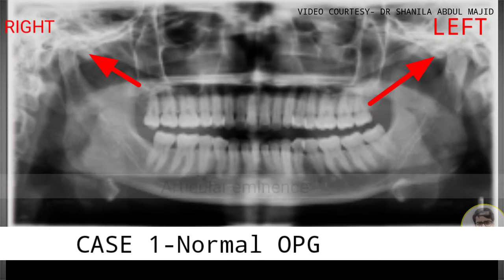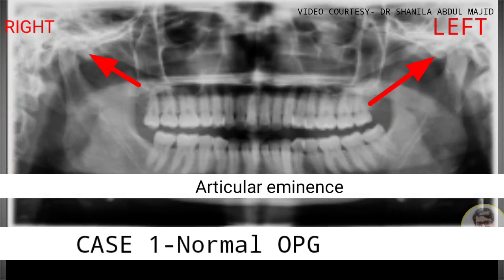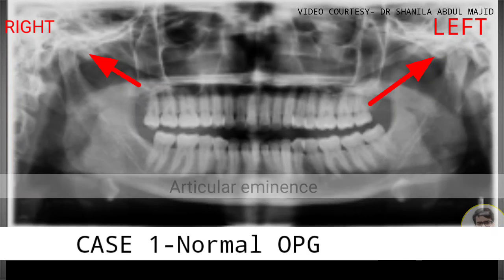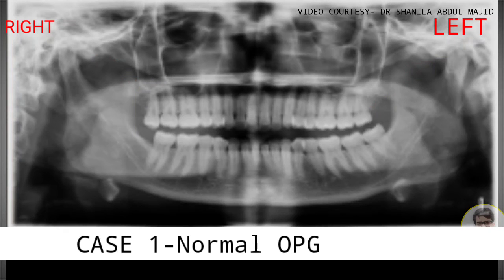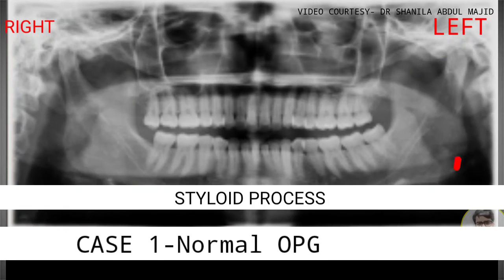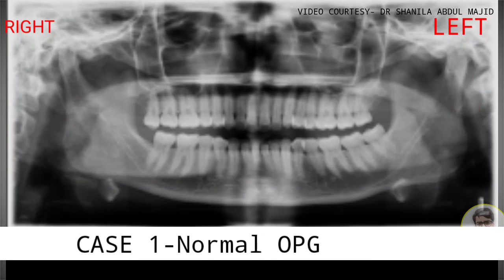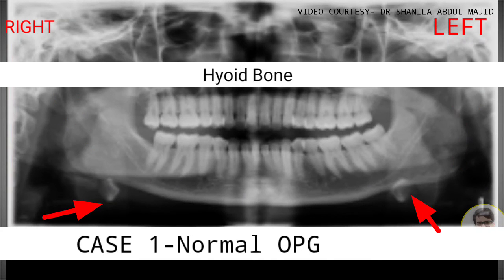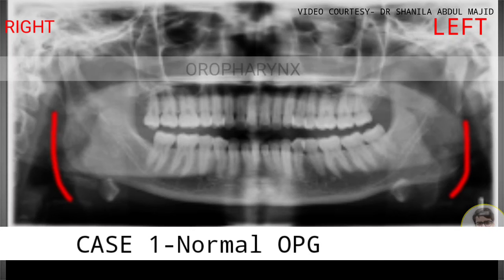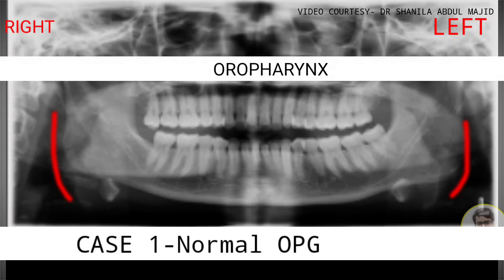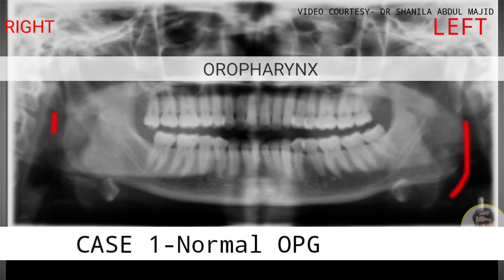On the articulating surface of the head of the condyle, you can see anterior to that is the articular eminence. This should be noted in cases of TMJ — we have to see the head of the condyle as well as the articular eminence. This is followed by the styloid process, the hyoid bone, and then the radiolucent structure that we see is the pharynx — that's the oropharynx region.